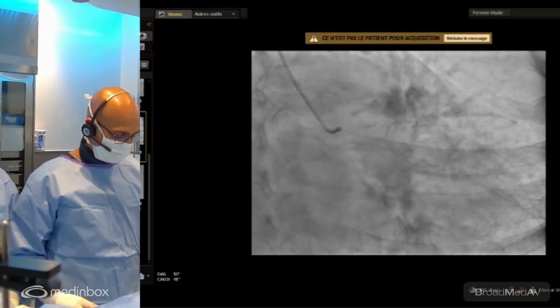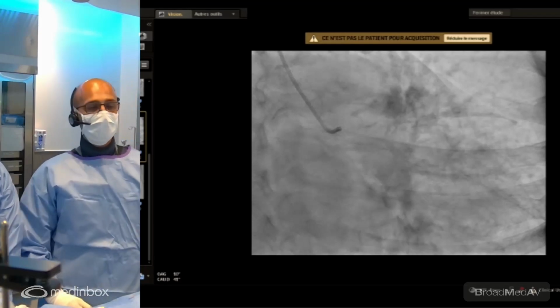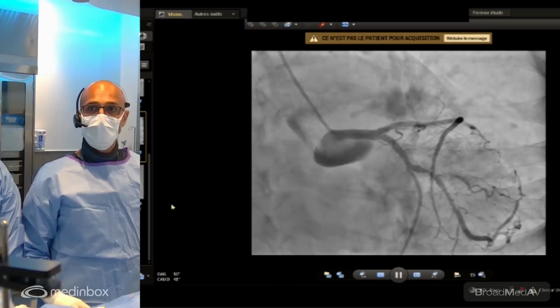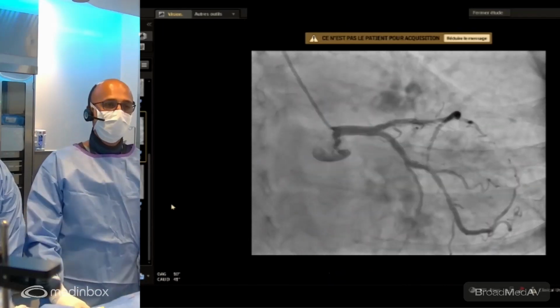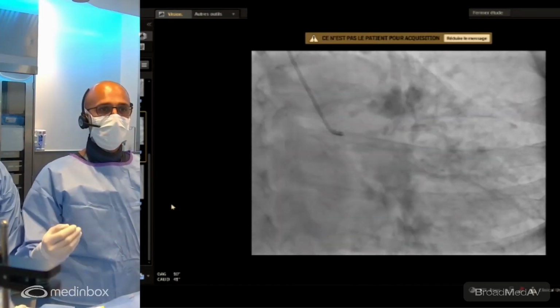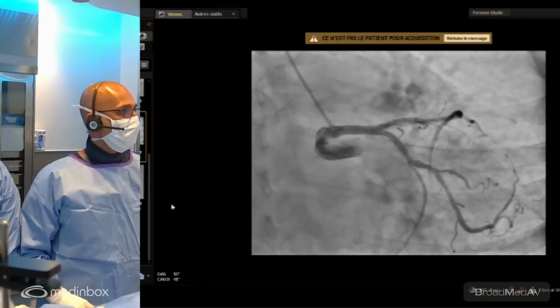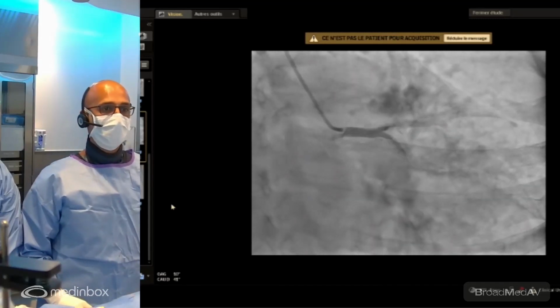So the best way to evaluate that is to interrogate it. We decided to perform an iFR, diastolic waveform measurements. Here we're working in a Philips room, so luckily we have access to the iFR pullback, which helps you determine if there's a step down, a step up, and at which point is the most significant disease. So can we show the IVUS pullback, the iFR, please?